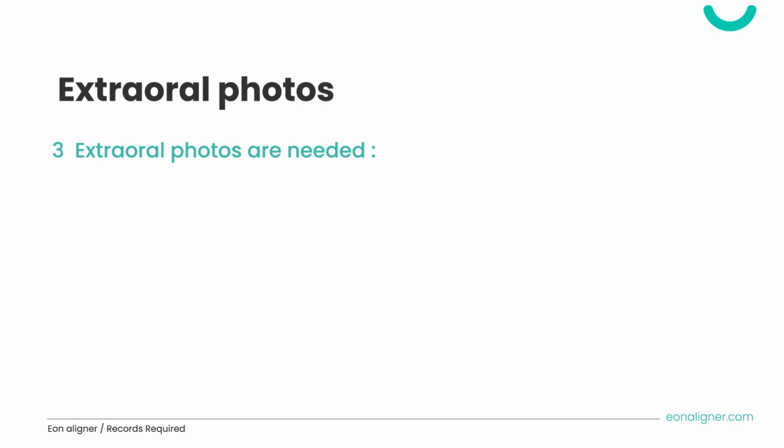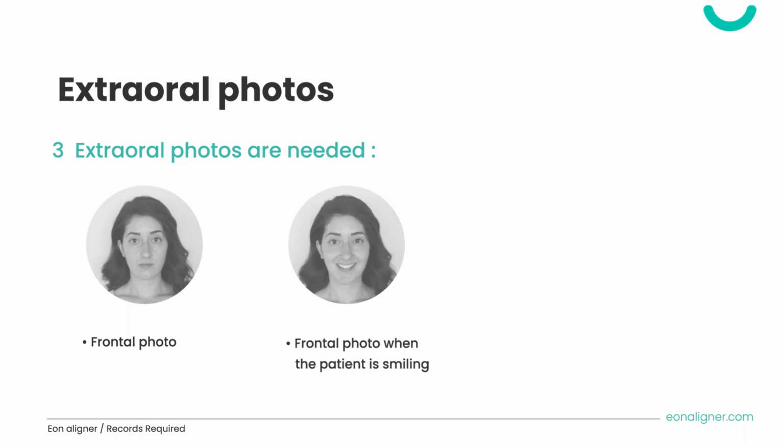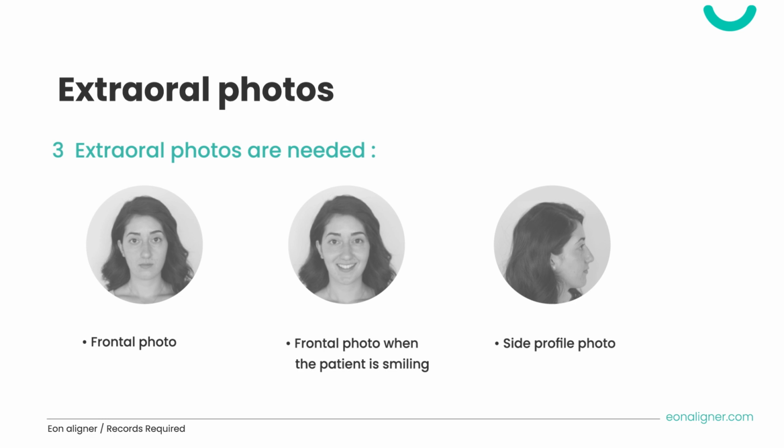Extraoral photos. 3 extraoral photos are required. The first one is a frontal photo. The second one is a frontal photo with the patient smiling. And the last one is a side profile photo.